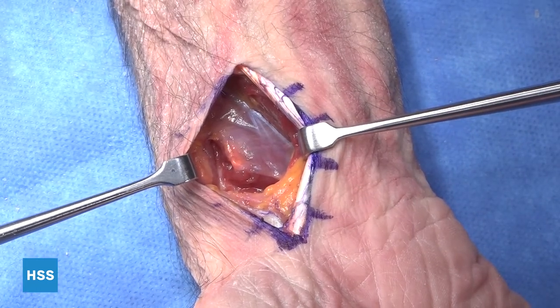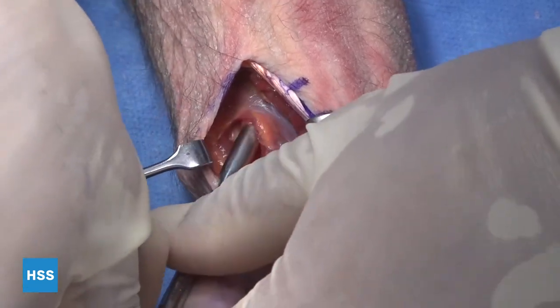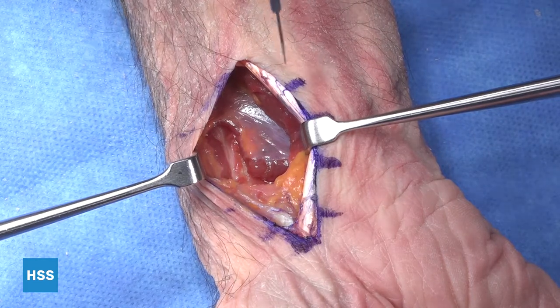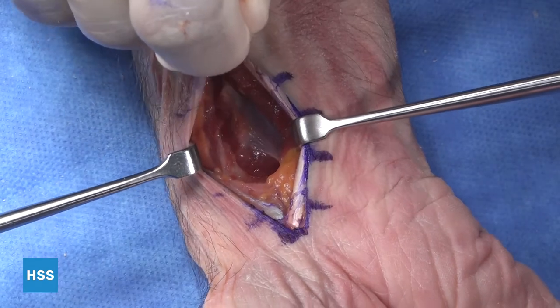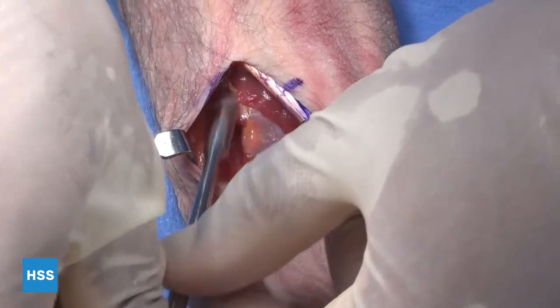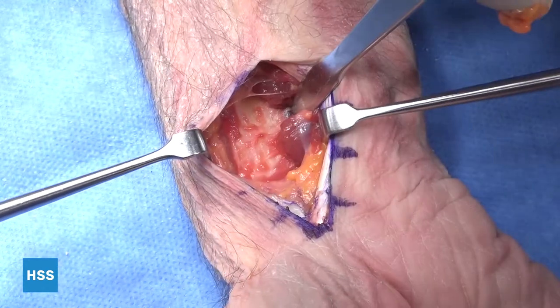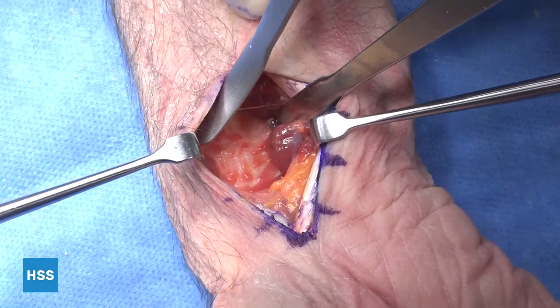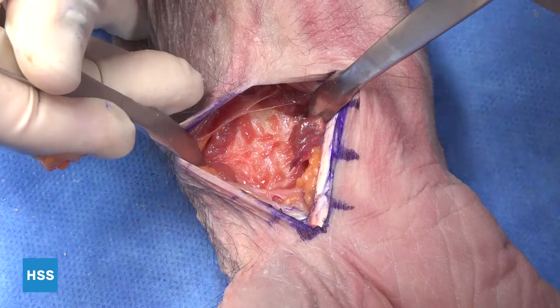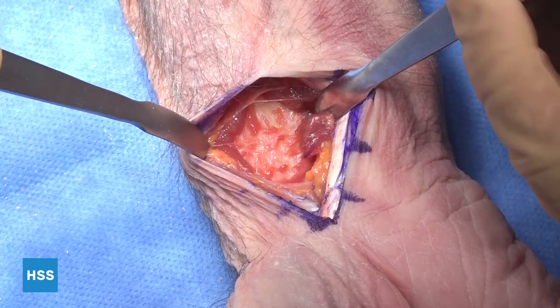There are many different ways to elevate this structure, but in this case we're going to take a rasp or elevator and gently get underneath the pronator quadratus and take it in one structure. We free it up radially, then go back to our elevator, and now you can clearly see the volar aspect of the distal radius. We'll place thin small Hohmanns on each side of the distal radius, remove our retractors, and now the distal radius is clearly visualized. The most common location for these fractures is right there. That is the Volar-Henry approach to fixing distal radius fractures.